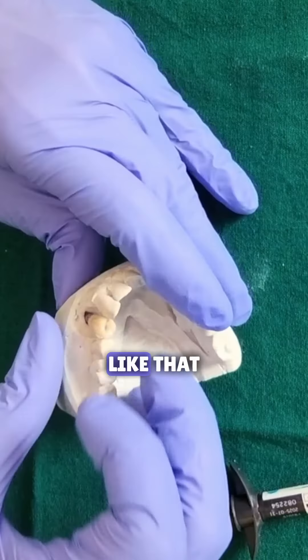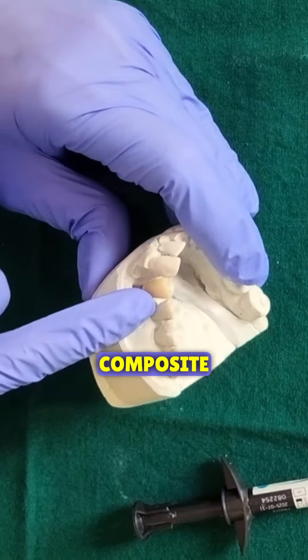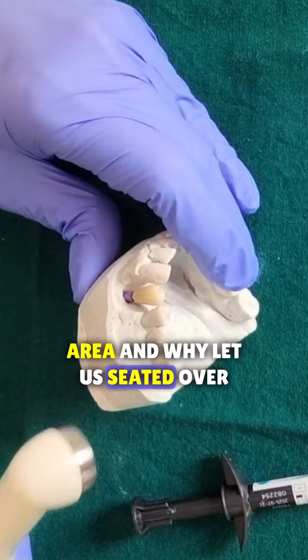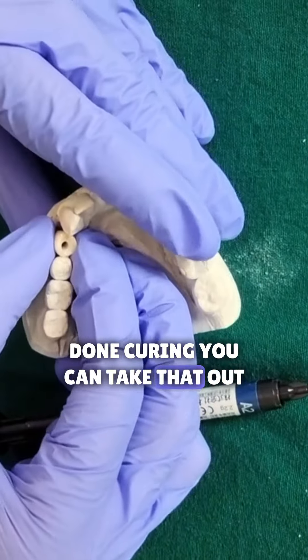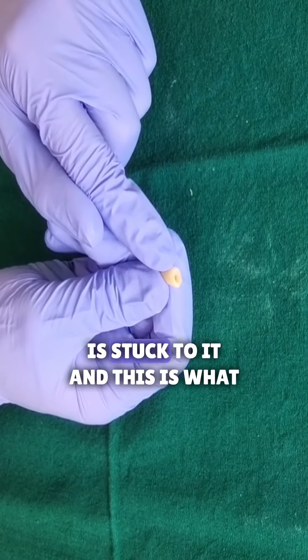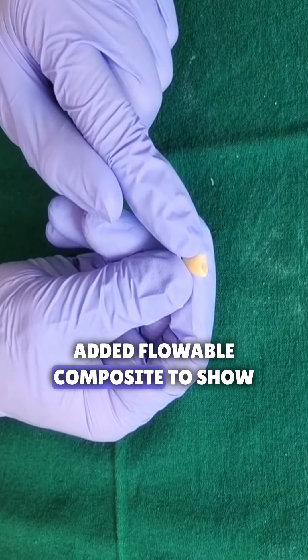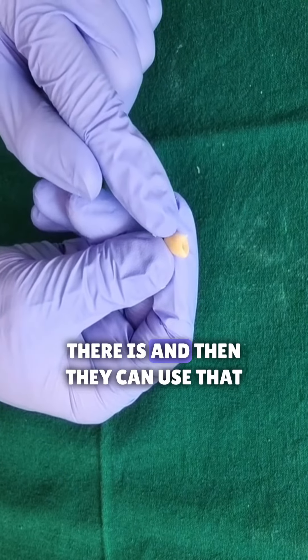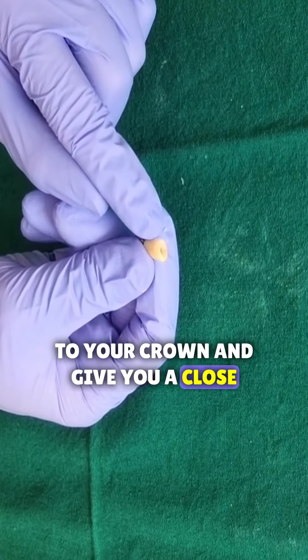Don't do any kind of sculpting like that. So now there's flowable composite right there in the open contact area, and while it's seated over there, you can cure this and once it's done curing, you can take that out. So now once you take this crown out, there's a little bit of flowable composite which is stuck to it, and this is what you're going to send to the lab. Inform the lab that you've added flowable composite to show them how much of an open contact there is, and then they can use that information to add the ceramic to your crown and give you a closed contact.